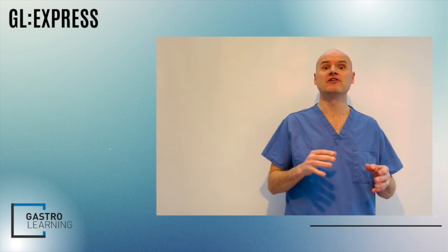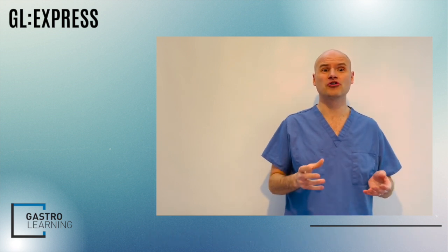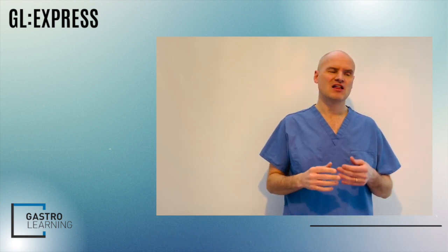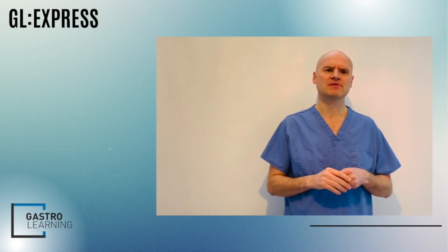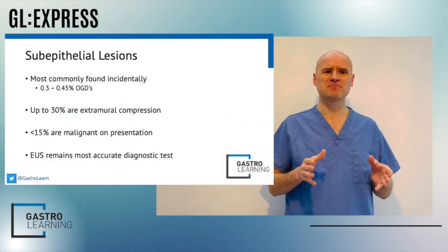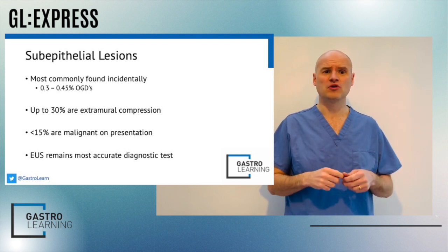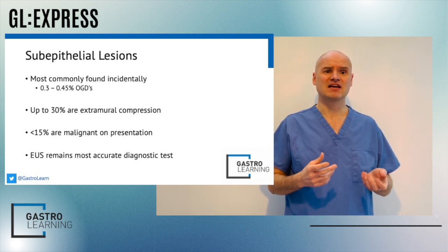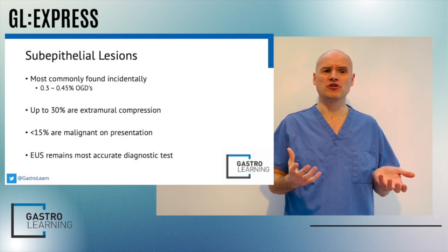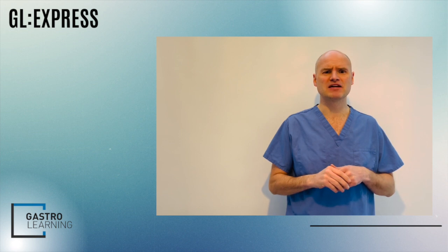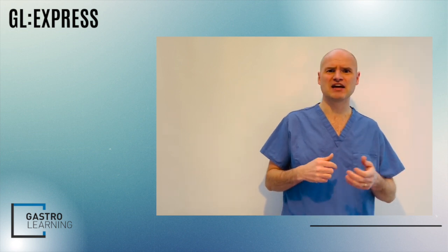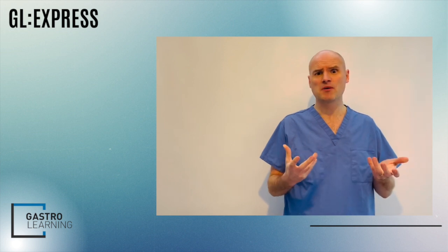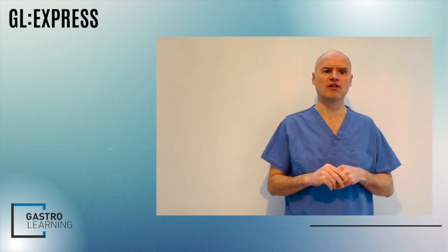The finding of a sub-epithelial lesion at a diagnostic endoscopy is a bit of a heart-sink event that, according to data, happens in about one in 300 procedures. They're quite often incidental, small, and asymptomatic, and we don't really know what to do with them. This creates a really difficult conversation with patients about the options of surveillance, resection, or simply doing nothing. This is how I approach them, taken from the various guidelines out there.